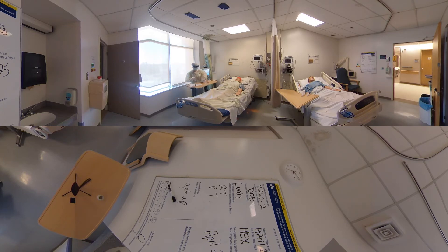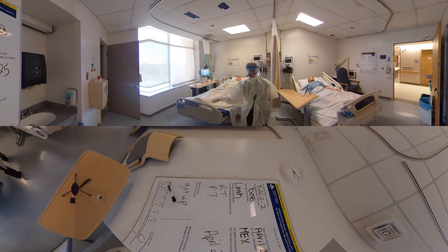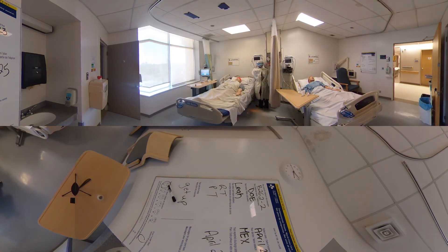Now I'm just going to do your vital signs quickly if you don't mind. I'll put that on your finger and scan your bracelet. I notice your oxygen is a little bit low — it's about 88%. So what I'm going to do right now is bring your head up a little bit so it's easier for you to breathe, and I'm going to turn your oxygen up. You're sitting at 3 liters right now; I'm just going to turn it up to 4 and see if that might help.